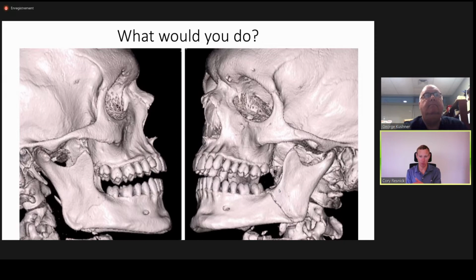But you know where that awl is by palpation, and you just slide it right along the border of the mandible in one direction or the other. And then if you're going lingually, which tends to be my preference for the first pass, then you just have it slide up the lingual border of the mandible, have it really curve around the mandibular shape so you're not heading out into the floor of the mouth, into the tongue base, into the submandibular duct area, into danger zones. You're really just hugging the lingual border of the mandible right behind the teeth, and then the awl pops right through the mucosa.